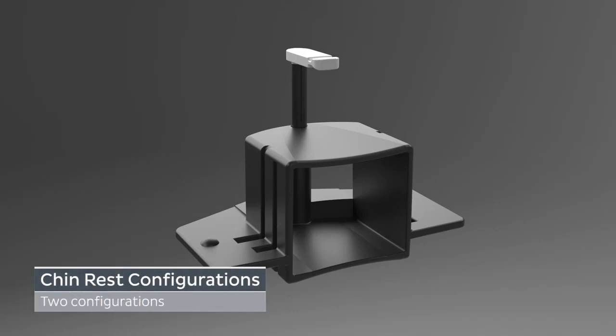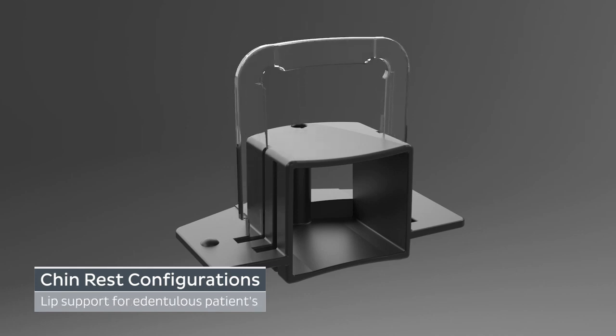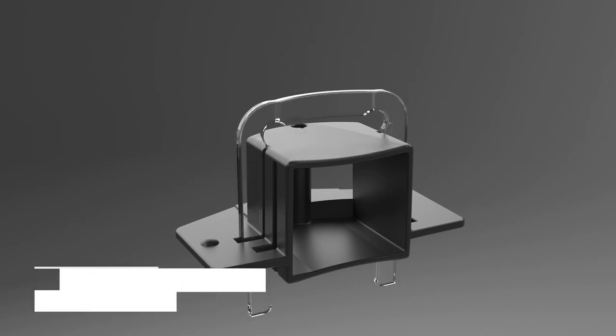There are two chin rest configurations that can be used when acquiring a 2D panoramic image: standard panoramic and pediatric panoramic. Both require the bite block and chin rest, except for edentulous patients that require the use of the lip support and chin rest.